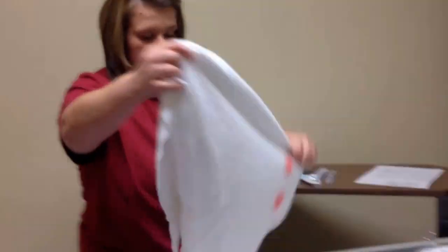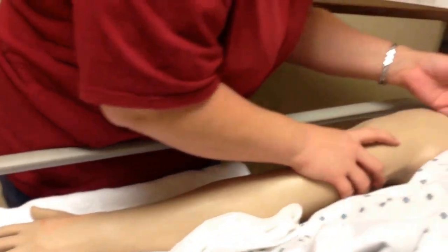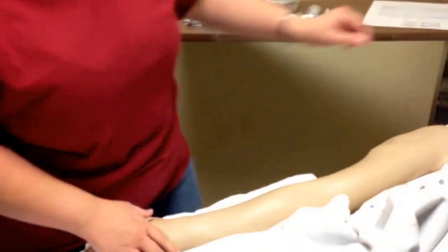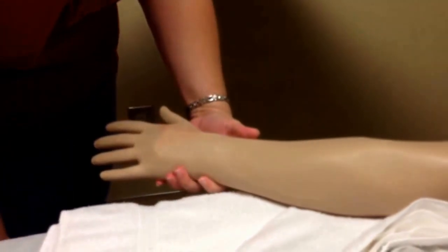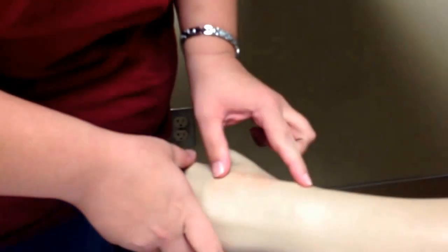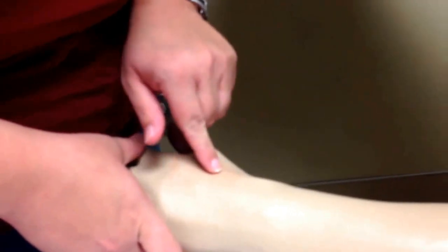Mr. Dunn, I'm going to place a towel under your arm. This helps us not mess up the bed, because you may make a little bit of a mess when putting in an IV. I'm going to look and see what veins I have available. I'll ask him to hang his hand down in the dependent position and make a fist for me. I see a good vein. You want a vein that's as straight as possible with no valves — soft, spongy, and bouncy. If it feels hardened, you'd want to avoid that vein.